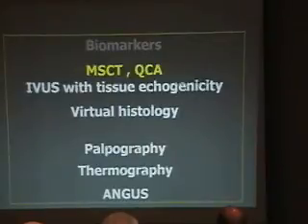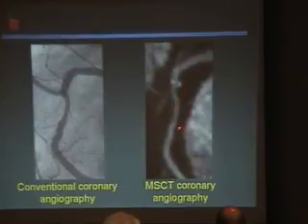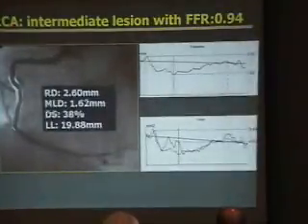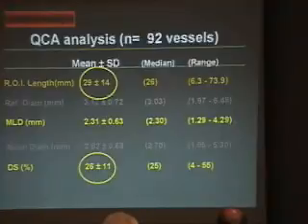The next step is to do the multi-slice CT scan and the coronary angiogram. I've shown you these pictures. You see the resolution of the multi-slice CT scan. You have this nucleus of calcium. You have certainly some soft material in the vessel wall of these patients. And if you do the coronary angiogram, you will find a lesion of clearly less than 50%, in this particular case 38%. But if we do the statistics of the 85 individuals that we have studied, the diameter stenosis on average was 26%. We are clearly addressing lesions which are non-flow limiting.